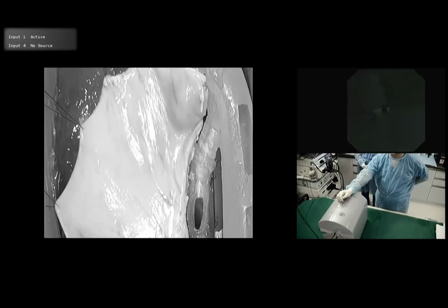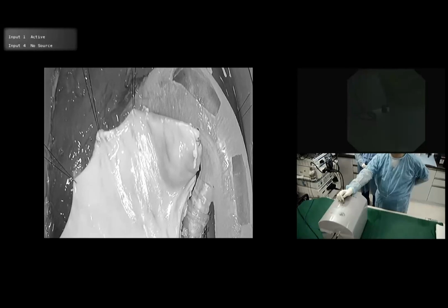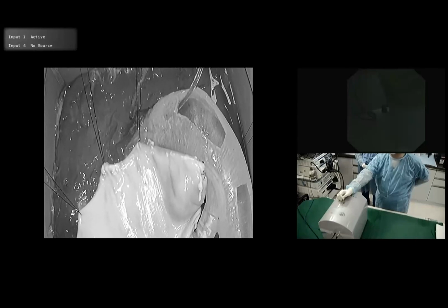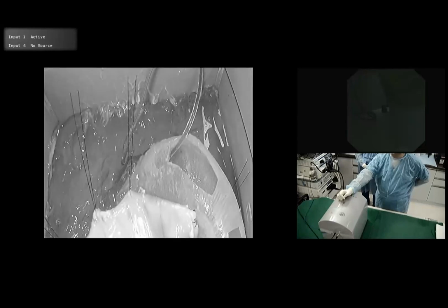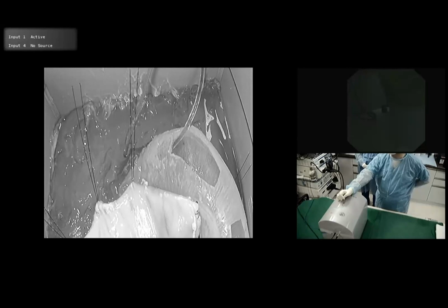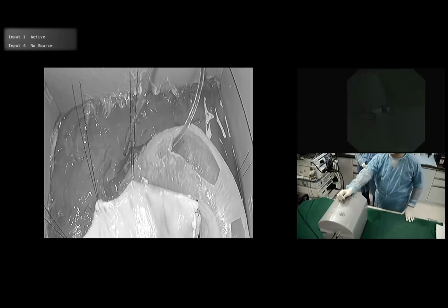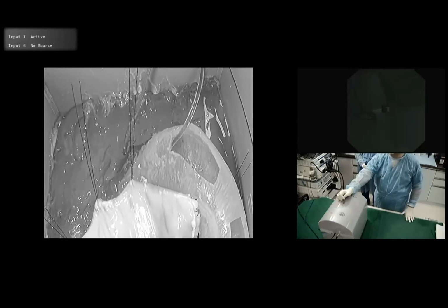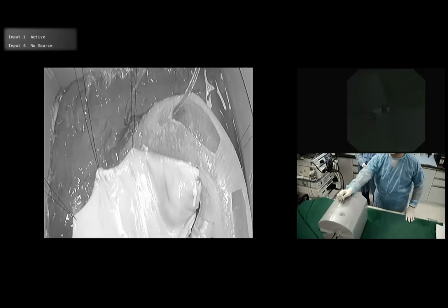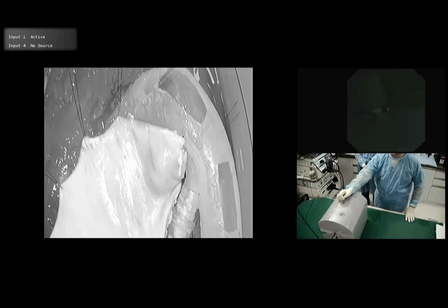also practice gastrojejunostomy. So you see this duodenum is going deep inside, and we have kept a tube here to fill it with water. We can also put a balloon to give an impression. Yesterday you saw Sandeep showing it beautifully. So we can inflate a balloon to stop the flow of water from going forward, and we can do axial stent placement. So this is the model.